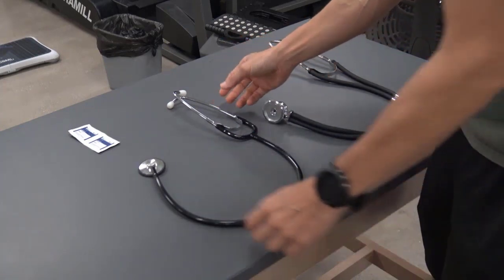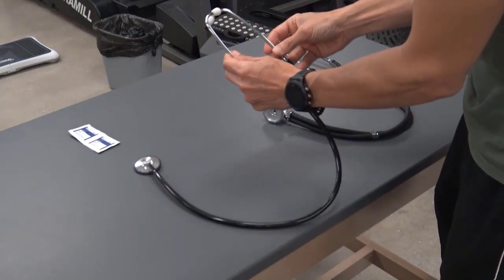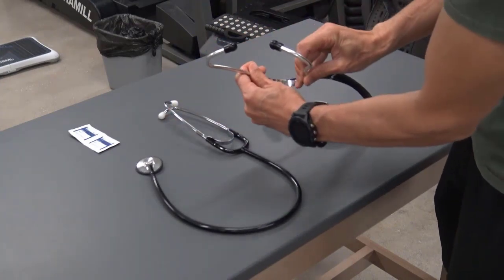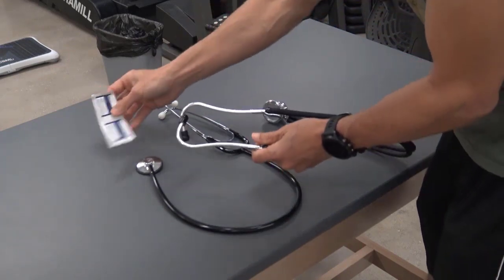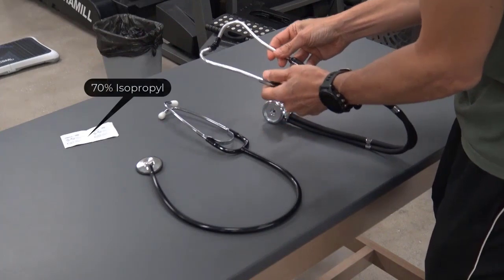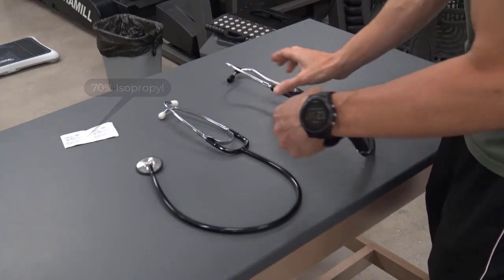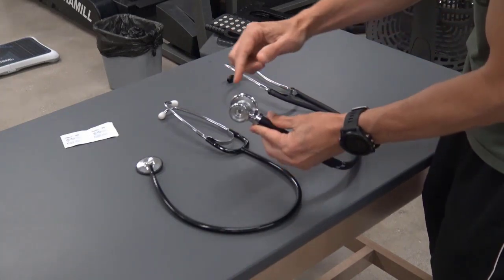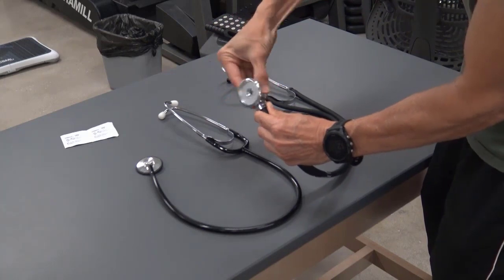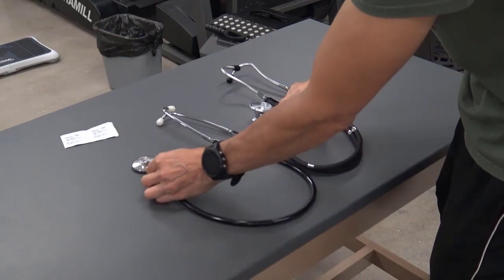Here we have some stethoscopes, the listening devices when taking blood pressures. These are the earpieces, and note how they're angled to fit into your ear canals. When you fit them, the earpieces should be pointed towards the nose. If you don't have your own stethoscopes, good practice is to clean the earpieces with alcohol before fitting them. The headset is connected to tubing down to the stem, which is connected to the bell and diaphragm. Some stethoscopes have a high and low frequency, so the bell can be rotated, and some stethoscopes are just set to a single frequency.